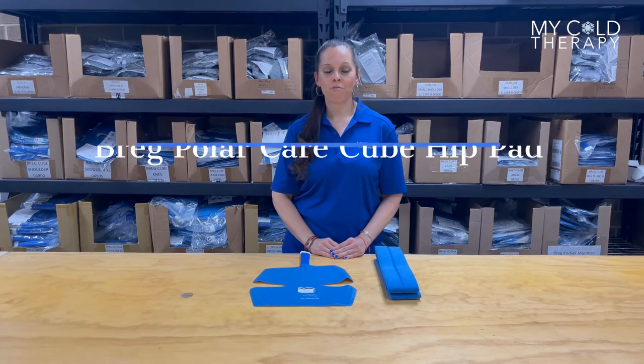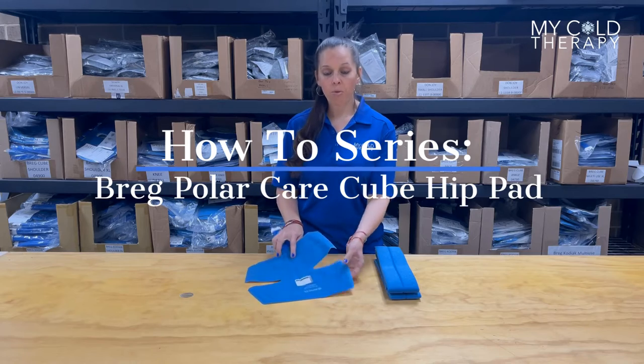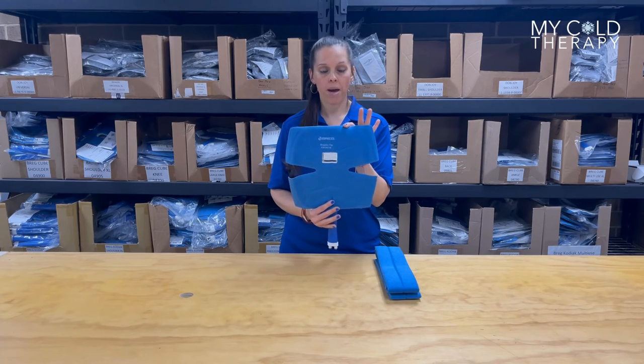Hey guys, Michelle here from My Cold Therapy, and today we're going to demonstrate how to apply the Breg PolarCare Cube Hip Pad.